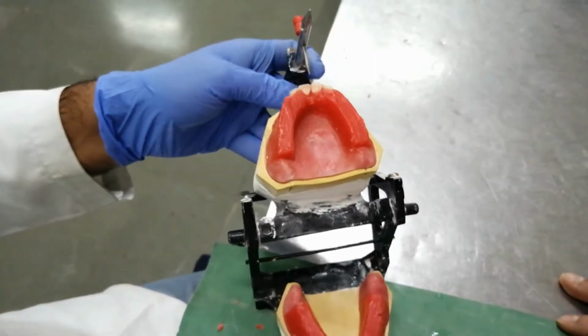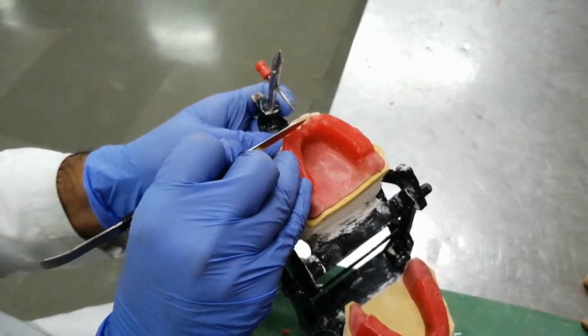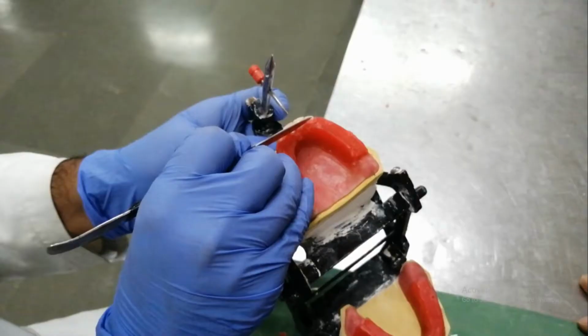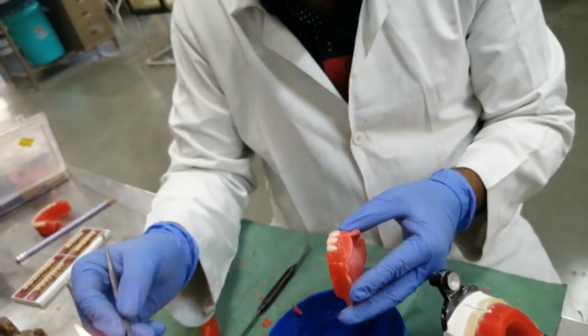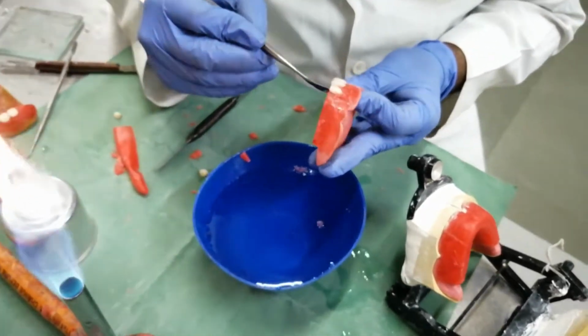You have to check the distal end of the one lateral incisor to the other, that it should be in a straight line. This will make sure that they are bilaterally similar and they are covering the exact same distance. Now we will scoop out the socket for canine.